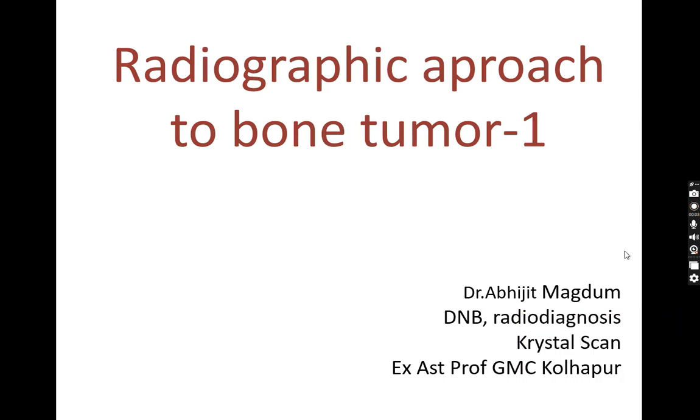Hello everyone. We will discuss the radiographic approach to bone tumors. It is important because it is a frequently asked long case in the final radiology exam and also for day-to-day practice as a radiologist. Even for orthopedicians it is important to detect the lesion on radiograph, to characterize it and to give a differential diagnosis.